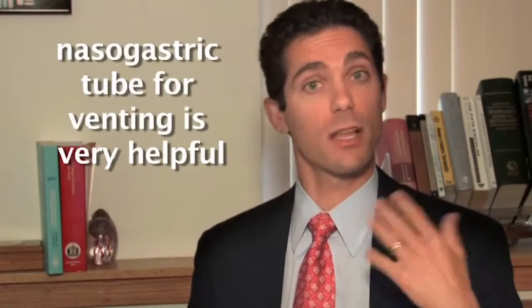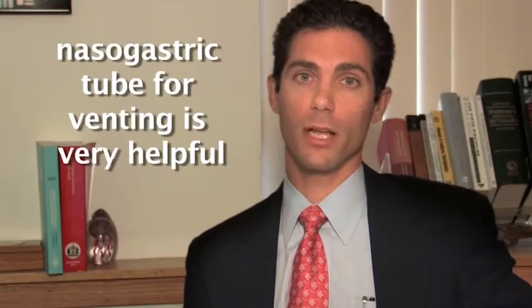So if you have a patient who has a nasogastric tube in for venting, that's very helpful. Or if they have an implantable gastrostomy tube, I would recommend venting that to allow air to escape so that you're not pushing up on the diaphragm, decreasing your functional residual capacity, and also increasing their risk of burping and aspirating any gastric contents.